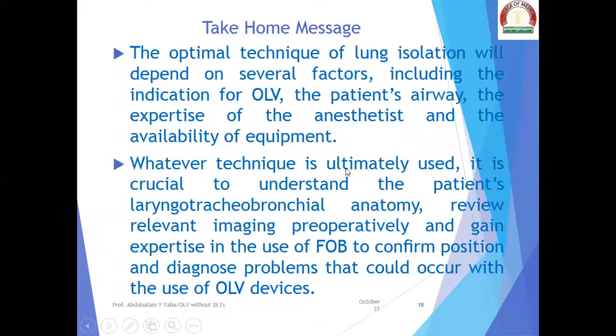Whatever technique is ultimately used, it is crucial to understand the patient's laryngotracheobronchial anatomy, review the relevant imaging preoperatively, and gain expertise in the use of fiber optic bronchoscope to confirm position and diagnose problems that could occur with the use of one lung ventilation devices.